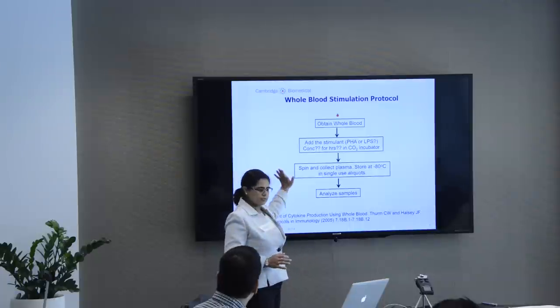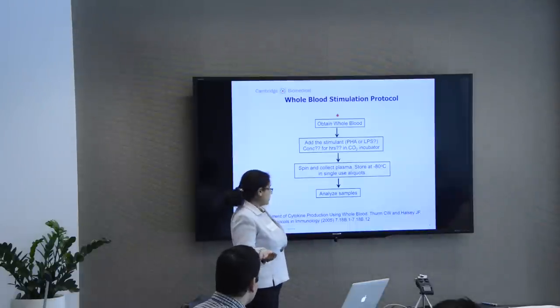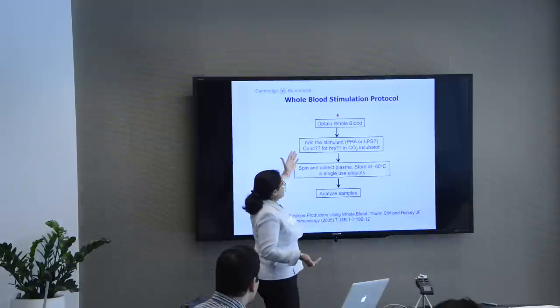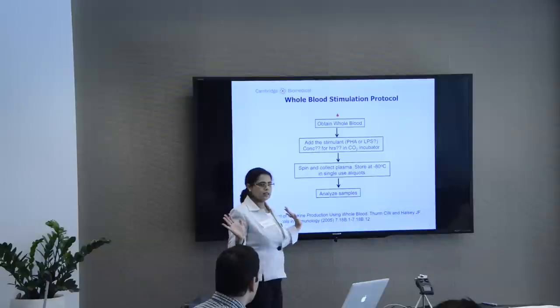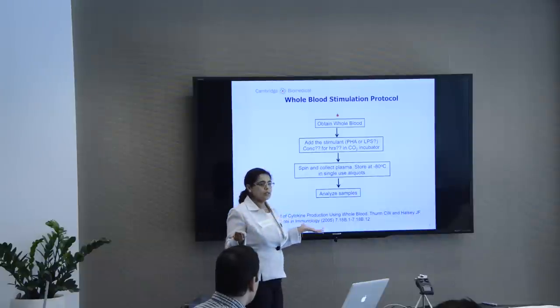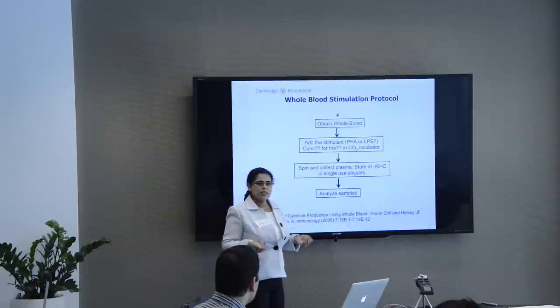You obtain whole blood, you add the stimulant, be it plant-derived or bacterial-derived, and then you add concentrations of PHA and LPS for a certain number of hours, and you incubate it. You spin, collect the samples that you need, the plasma samples, and you store them in single-use aliquots. And then you test. Did you get all those 15 cytokines that you need to measure within that stimulated protocol?